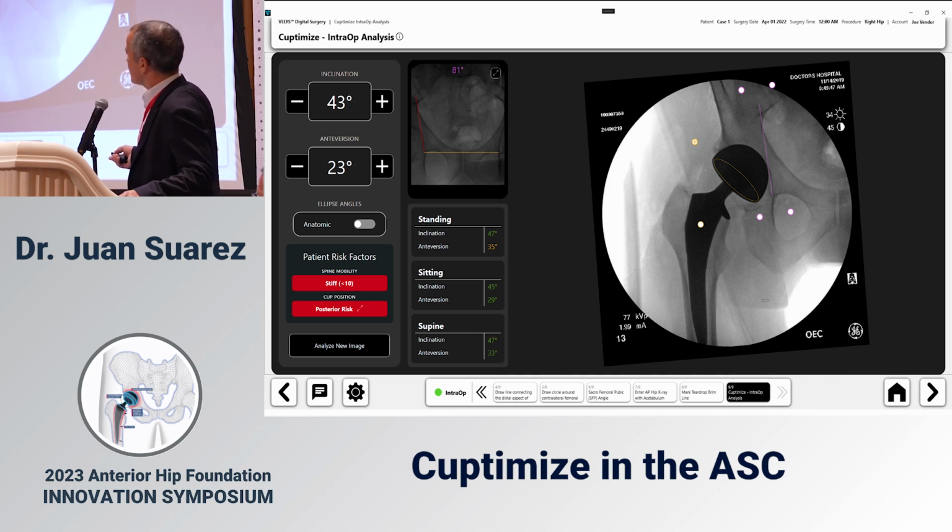In this specific case, I erred a little bit on the more anteversion side so I could stay within the confinements of the bony anatomy. So I recognize that and I use a dual mobility.